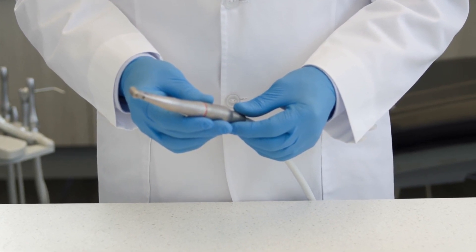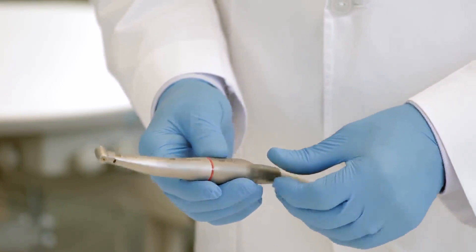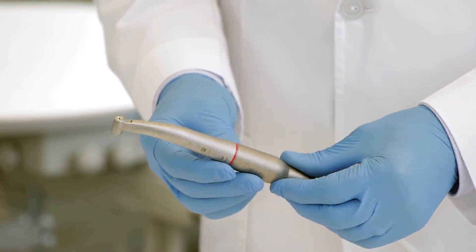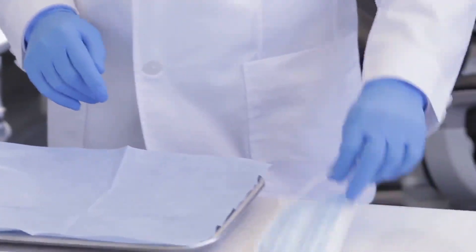Clean and lubricate the attachment as soon as possible after treatment. Failure to properly maintain the attachment may cause infection, product failure, or overheating leading to possible burn injuries. Always use personal protective equipment before the process.